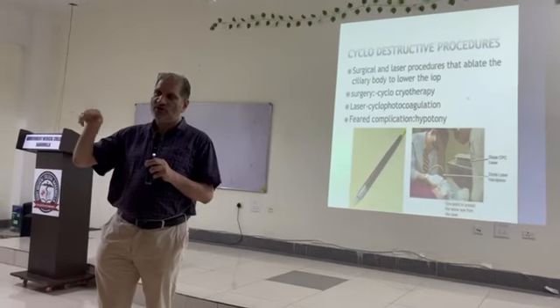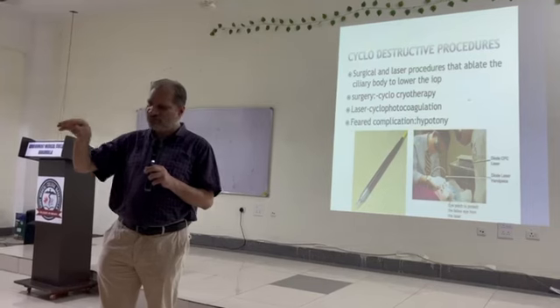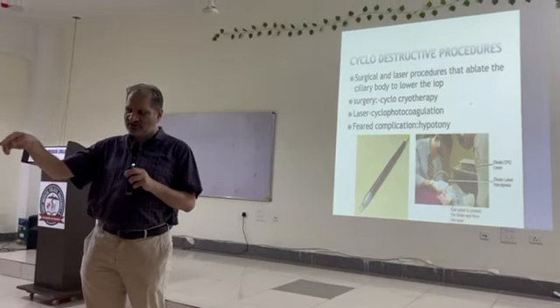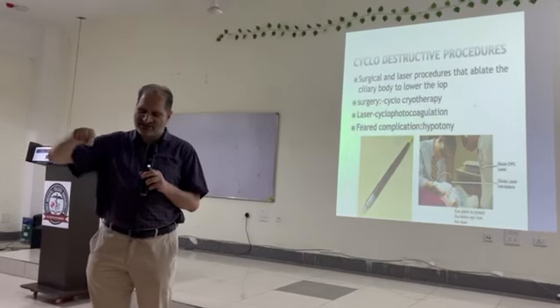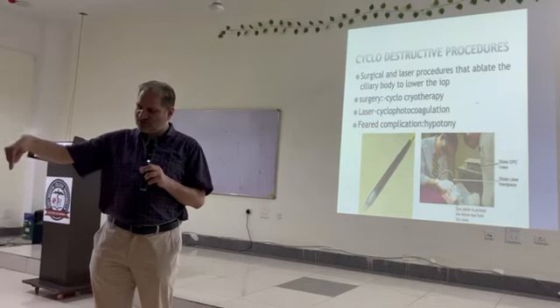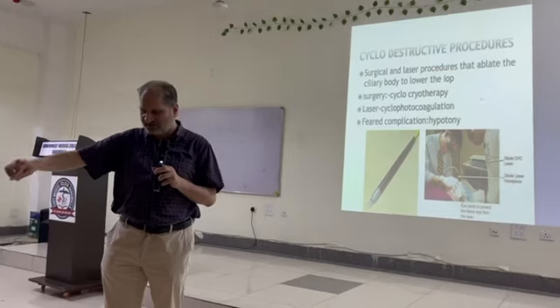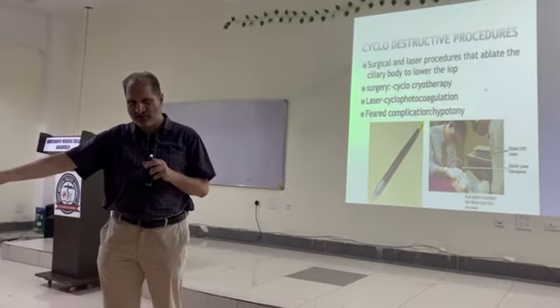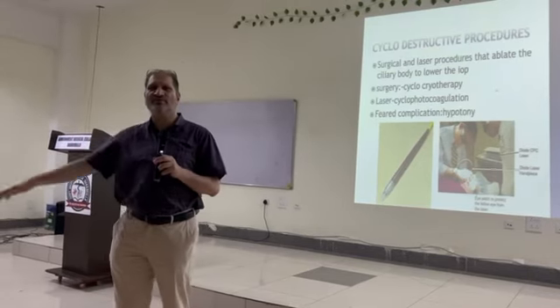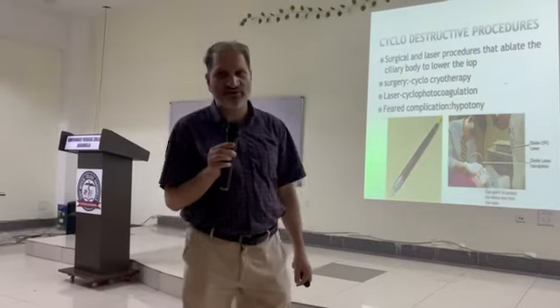Nylon thread, or a microcatheter, which has an illumination bulb. We put it through the Schlemm canal. Then we pass it 360 degrees like this. Correct, sir. Suppose that is going like this, then it is passing 360 degrees through Schlemm canal. Then it will be back as it is. Then we put this back. So we pass the whole way back here through the meshwork. This is called internal trabeculotomy.